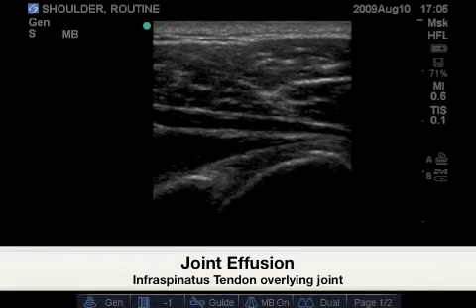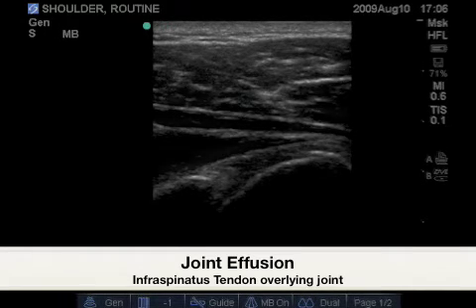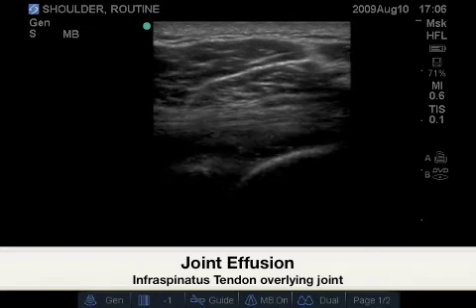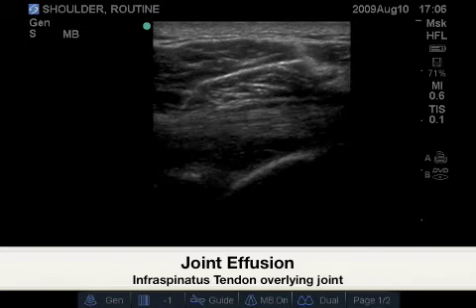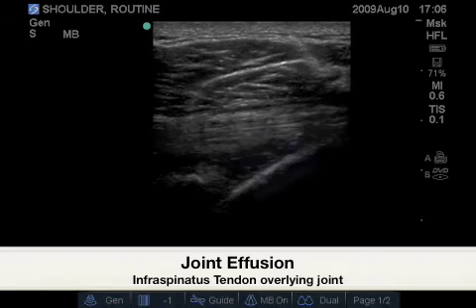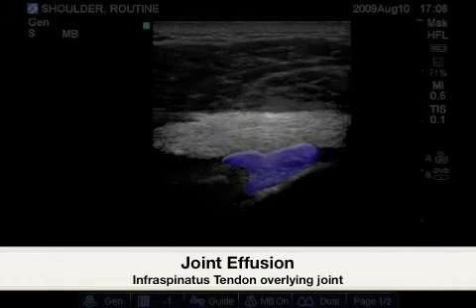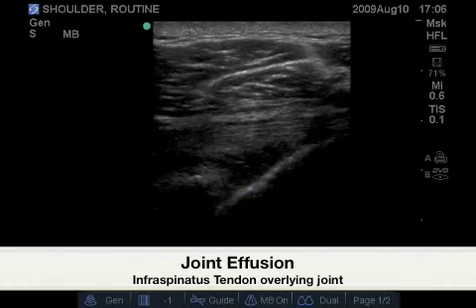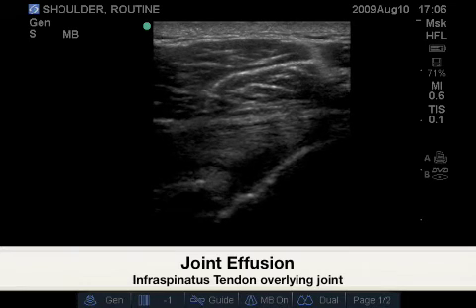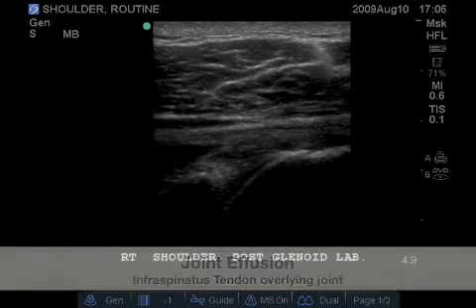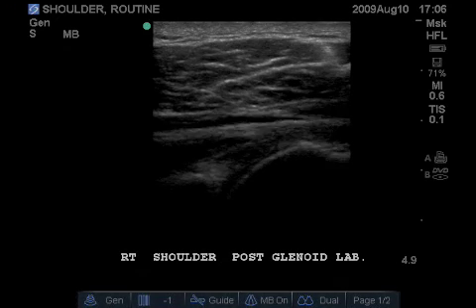Special care should be used when identifying a posterior joint effusion. By overlaying the infraspinatus tendon over the joint, this creates an interface for fluid to rest. Bringing this hyperechoic interface over the joint space makes it easy to identify true joint effusions, distinguishing them from artifacts.